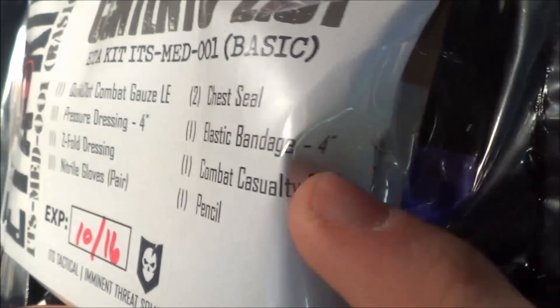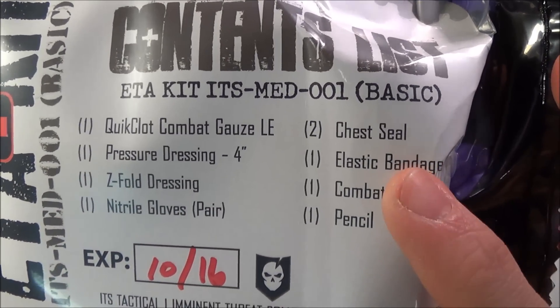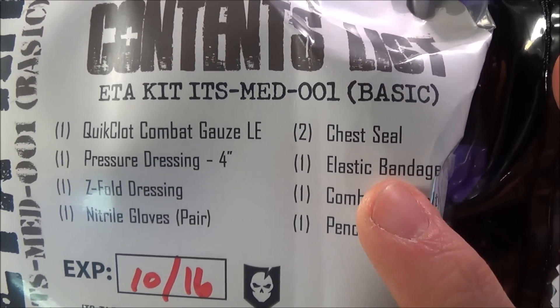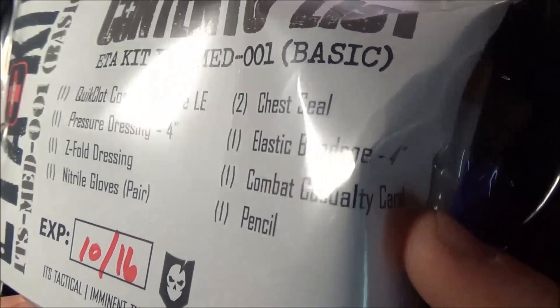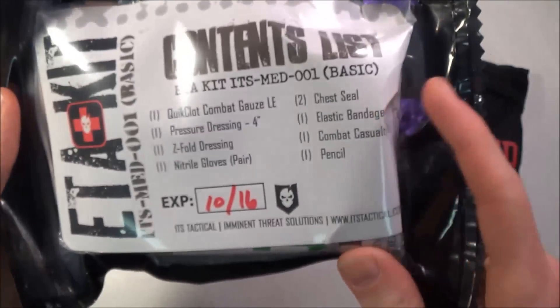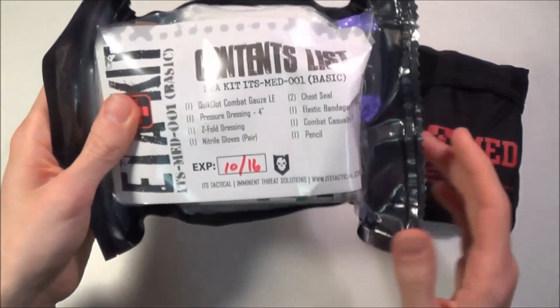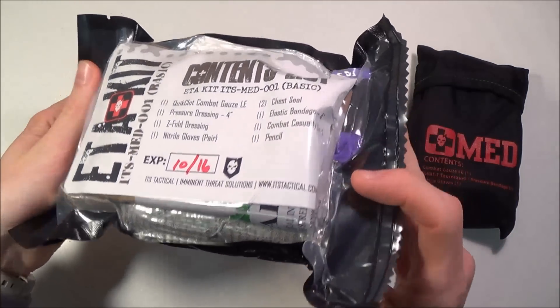You also get an elastic bandage, four-inch. There are some videos online showing how to use an elastic bandage as an improvised tourniquet, which would be a very cool and useful thing to learn. There's also a combat casualty card and a pencil so you can document patient information. The kit has an expiration date of October 2016 — I'm not entirely sure how all this expires, but it likely loses some sterility after that point since all these items are sterile in their packaging.